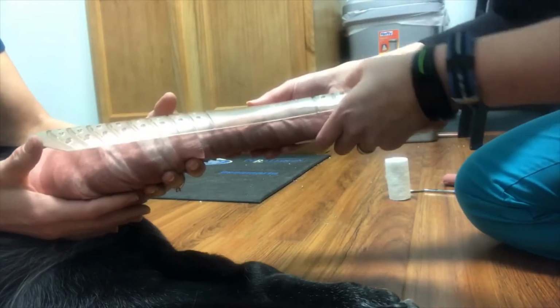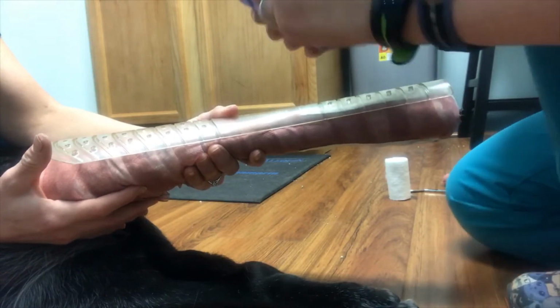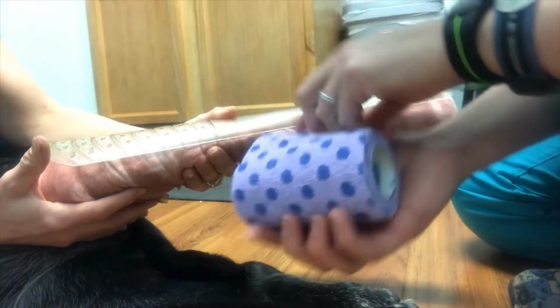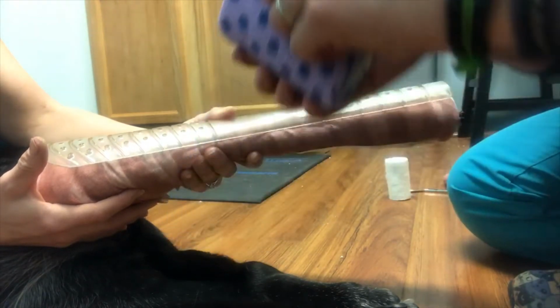So now I'm ready for my splint application. With the vet wrap, it is important that you don't cinch it down, as this is the constrictive part of the bandage. A good rule of thumb is any pattern on here, you don't want to stretch much past its normal design.